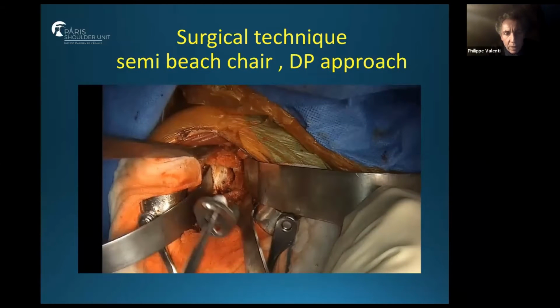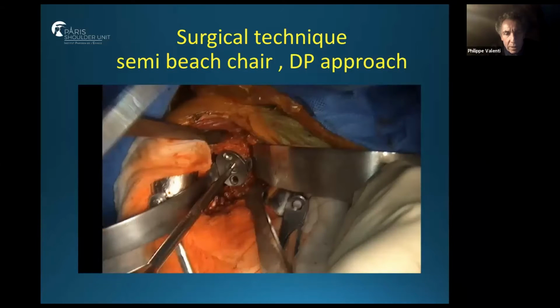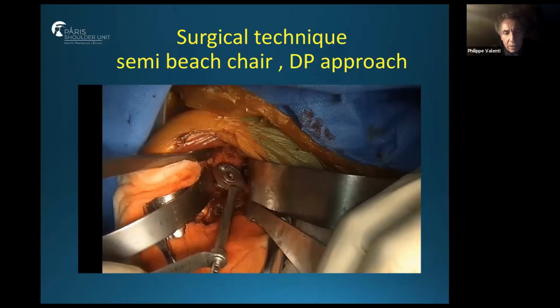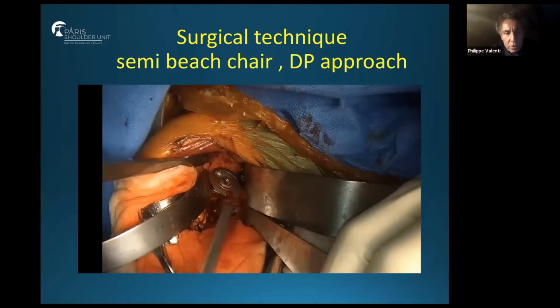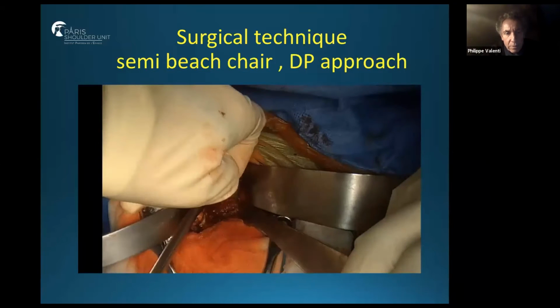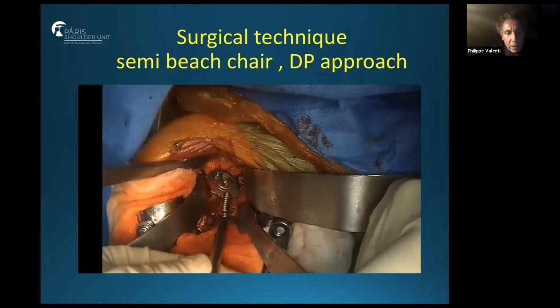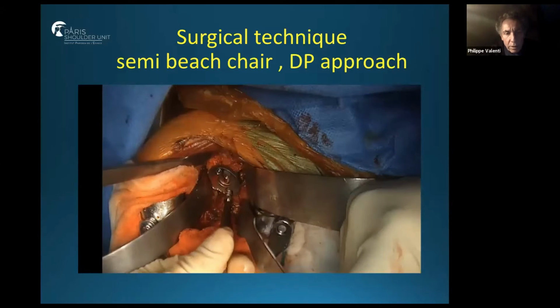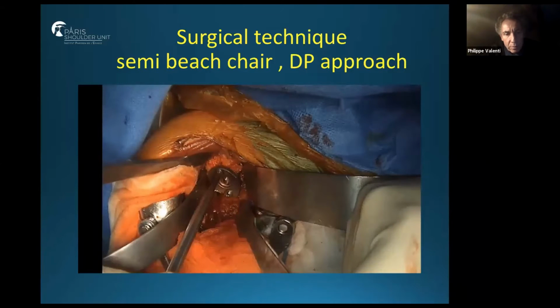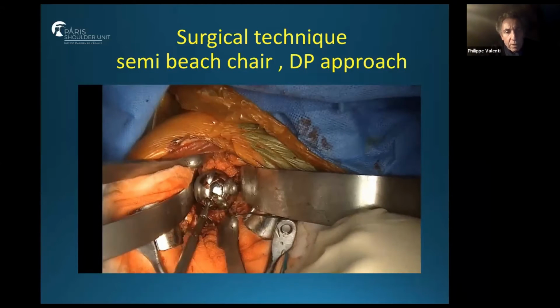After, we have a good press fit of the prosthesis, and we impact the prosthesis. Without screws, you see that we have a good fixation on the bone graft. We do a CT scan systematically, and we have 100% healing of the bone. I lock inferiorly first, and second superiorly, and I put the glenosphere. I impact the glenosphere and I screw the glenosphere into the base plate.